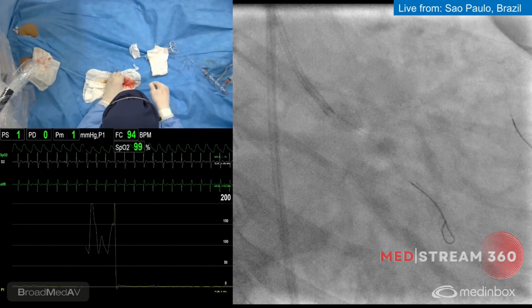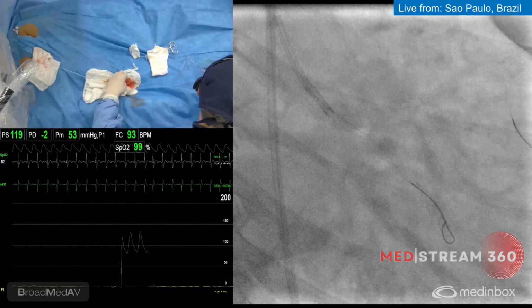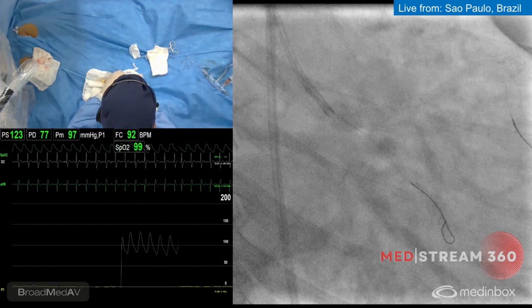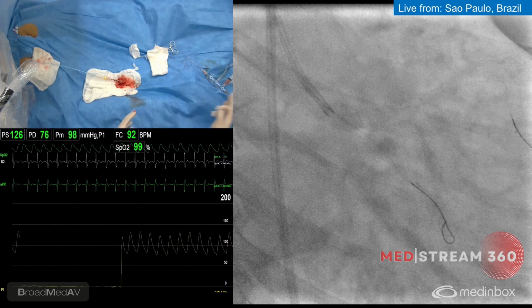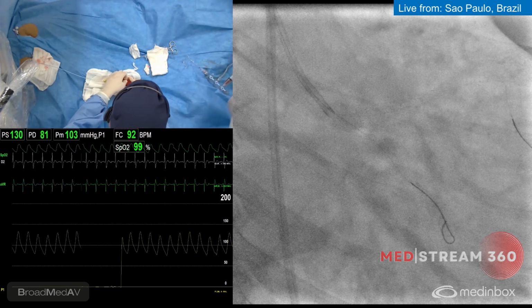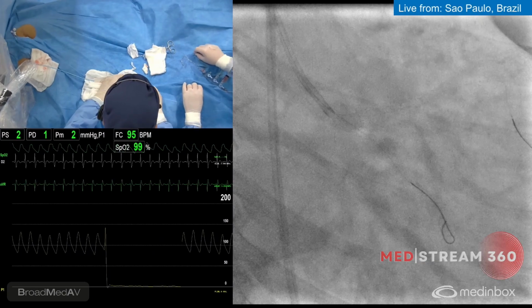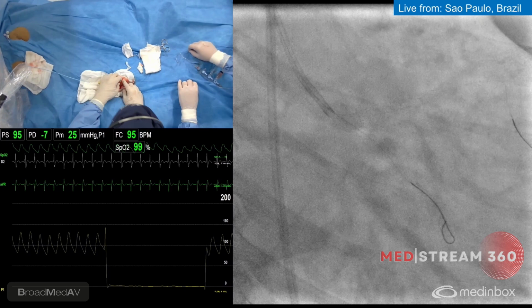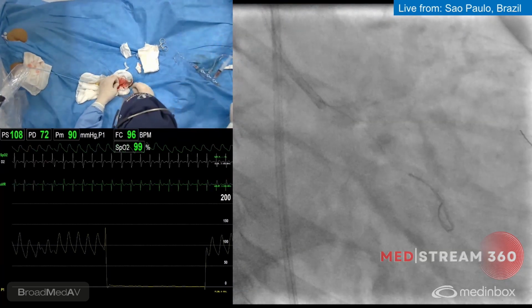What's the size of the left main? About between 4.5 to 5.0. So this balloon is only for the LAD. You're going to use a 4.5 balloon working from distal to proximal, to optimize the left main. You're going to keep the wires? Yes, I'll keep the wires. I'll just remove the circumflex wire when I recross if I decide to treat the circumflex.